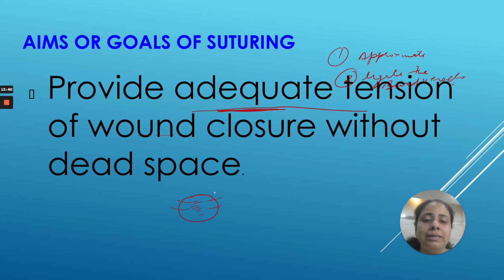What exactly is dead space? Dead space is the empty space which lies between the surgical site. If I am giving the incision here and doing my work here, whatever empty area I am generating is the dead space.